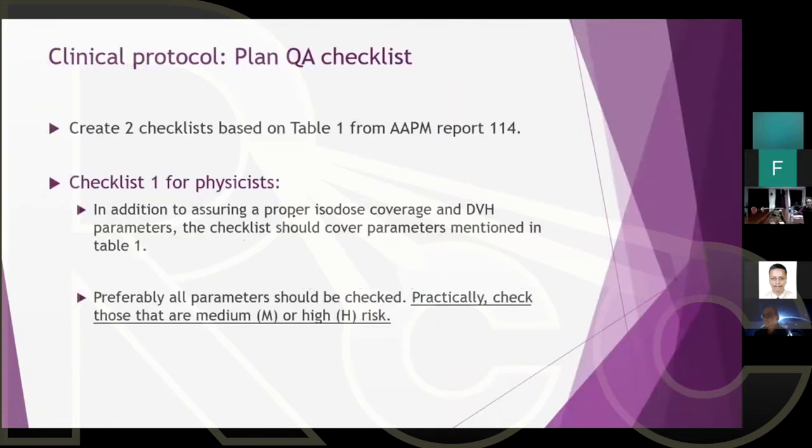Okay. Now the next thing we have to do is put a checklist for the QA.